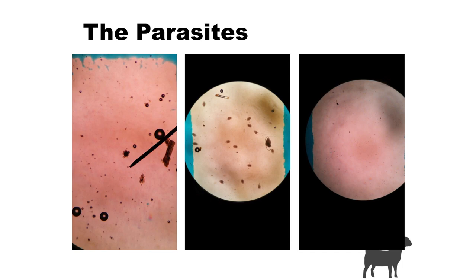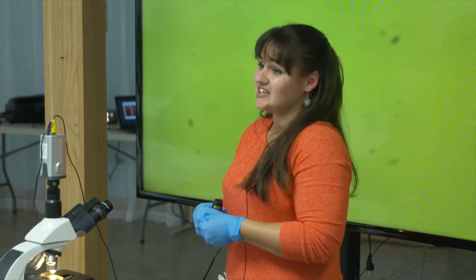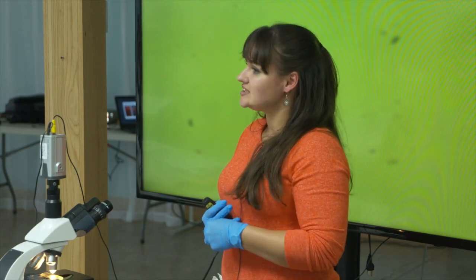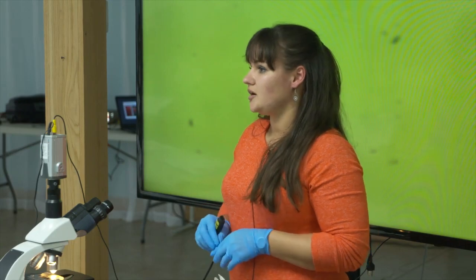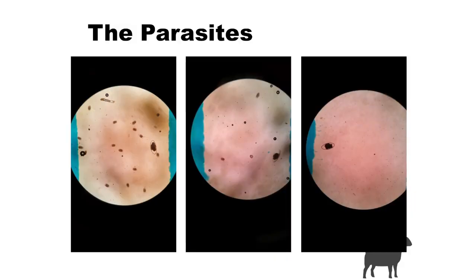In this slide we've got some strongylids and barber pole worm. There's also a nematode that's a special species — typically we don't have issues with that species, but we count it because it is a blood feeder going through the animal. Coccidia are really tiny compared to your strongylid eggs. One of the biggest things that's going to bother you — and this is why we take it straight from the animal or very fresh — is pollen. In early spring and during summer, pollen looks very suspicious and very similar to a parasite egg; it's round and looks like it should be one, but it's not.